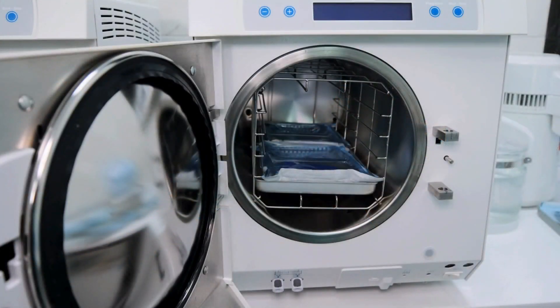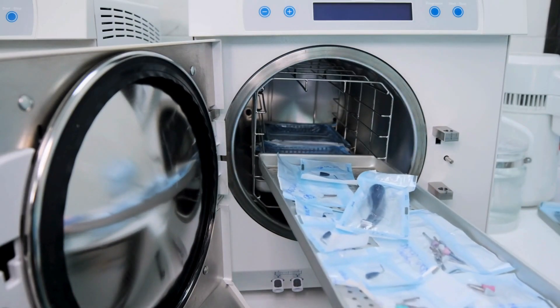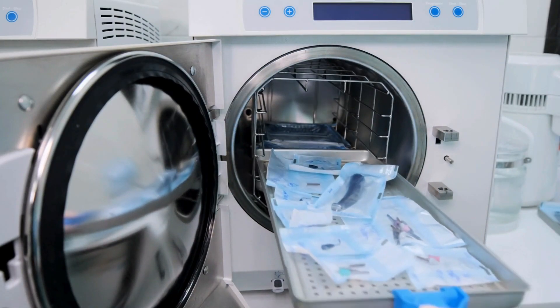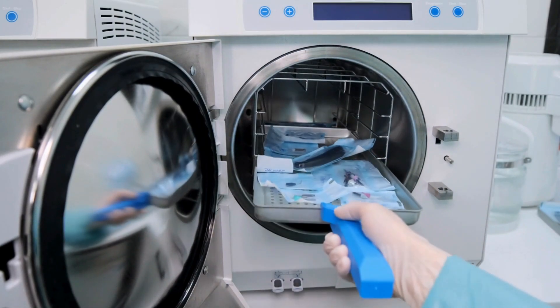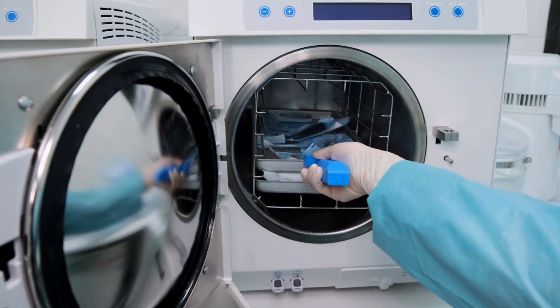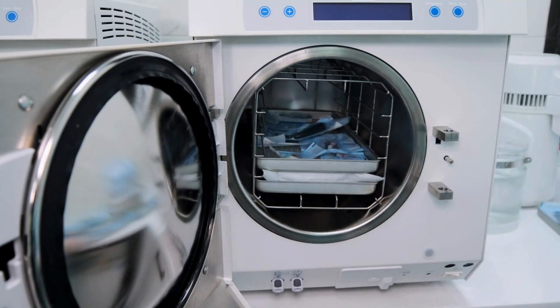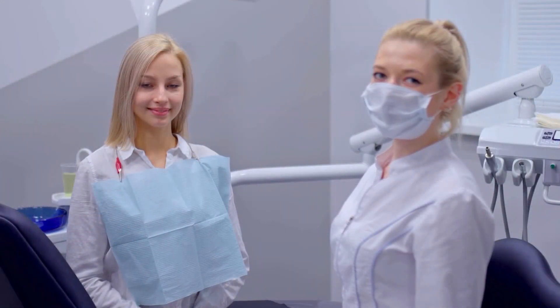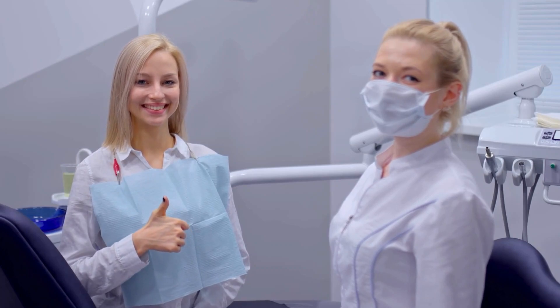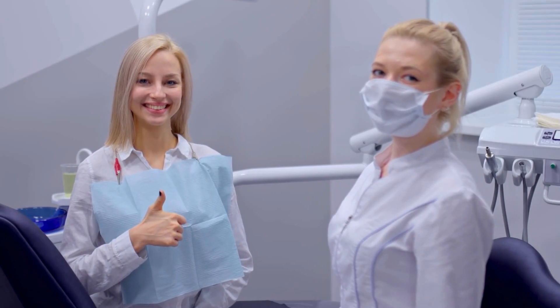Autoclave: it ensures that the hand tools used during treatment are sterilized. It provides sterilization with high-temperature dry air or pressurized steam.